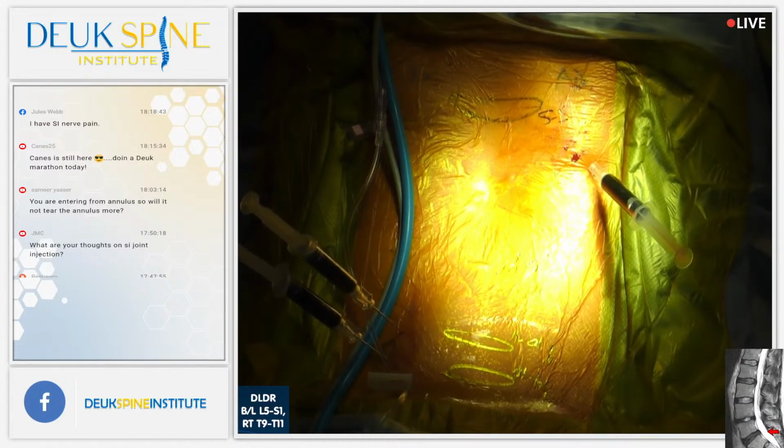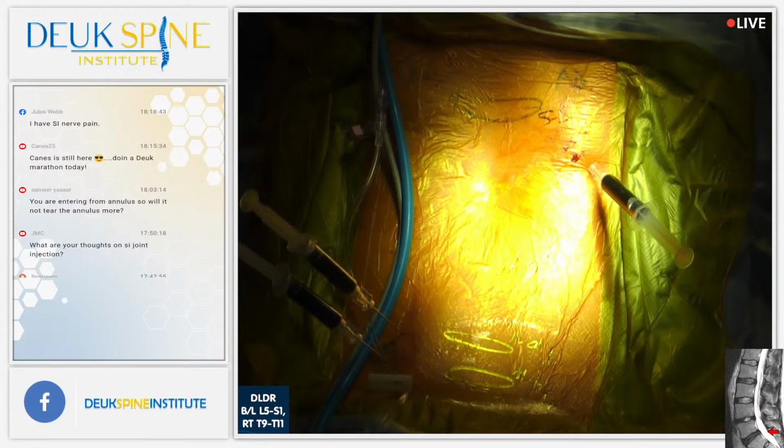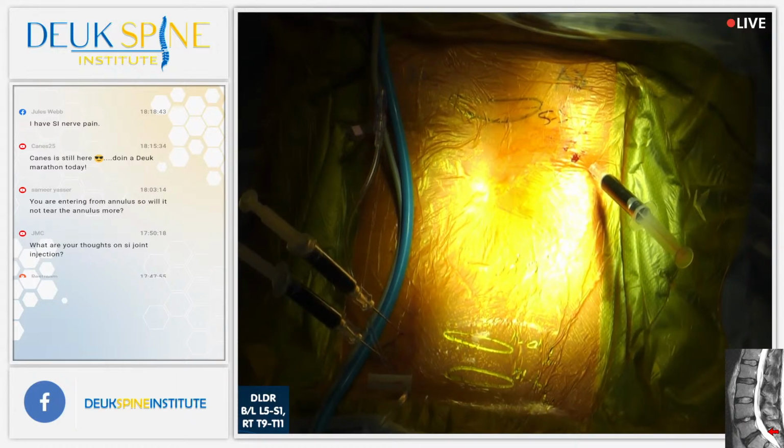Hey, Jordan, would you mind wheeling the fluoro up from the lumbar? Just show me the thoracic lateral. All right, just get a quick thoracic x-ray. I want to see how big those thoracic discs are. They're pretty good size. They're almost as big as a lumbar disc. So I think we're okay with a lumbar scope, Luis, because the thoracic discs are huge.